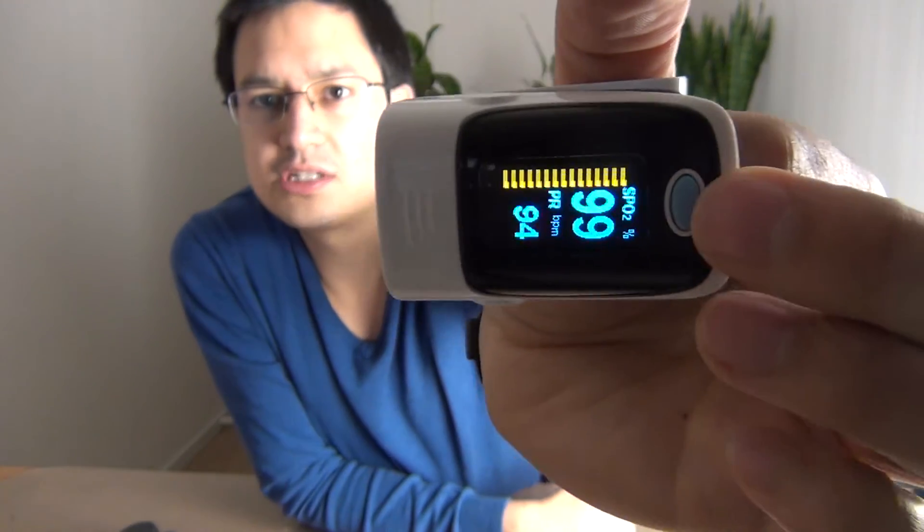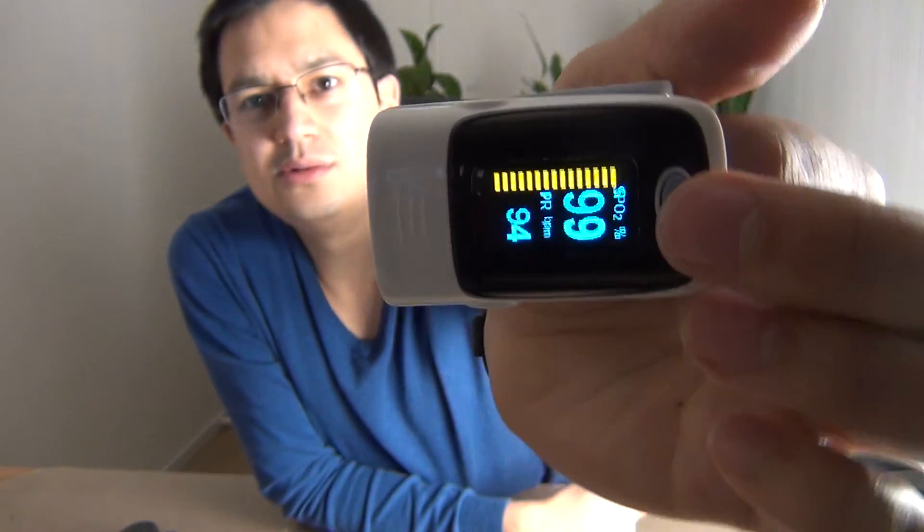The oxygen levels are also shown on the screen. You have multiple modes on the screen if you press the button.